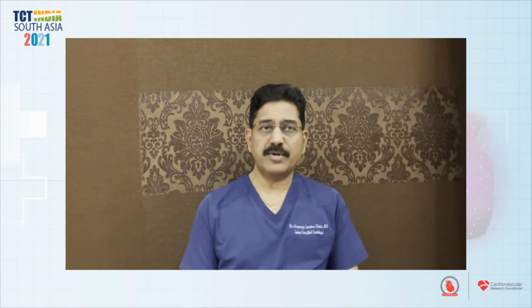To give an example, if a patient has a small aortic annulus or horizontal aorta or LVOT calcium, he thought self-expanding systems could be preferred to avoid problems like ruptures or other problems in delivery. On the other hand, if a patient is relatively younger and needs better coronary access on follow-up, he felt we could use balloon expandable valves, which could have easy coronary access on the follow-up.